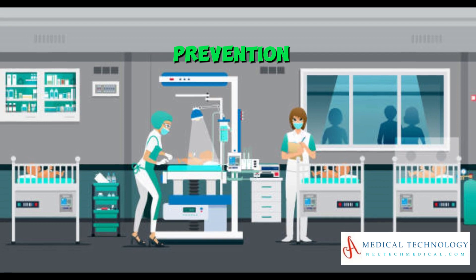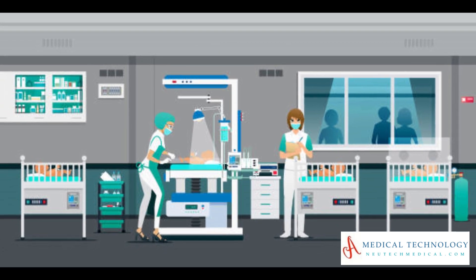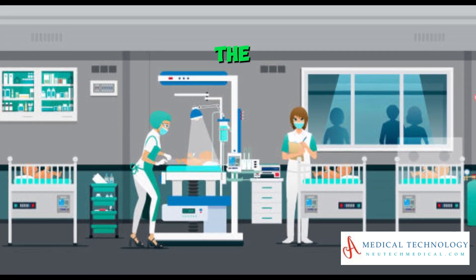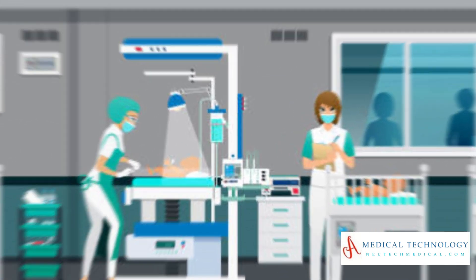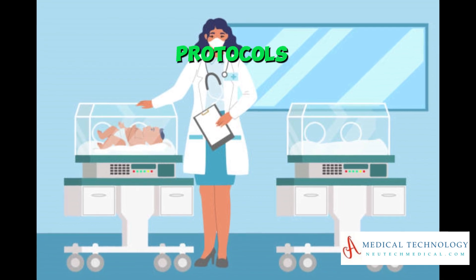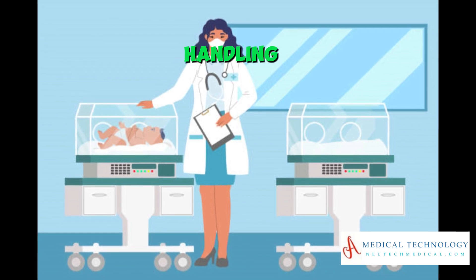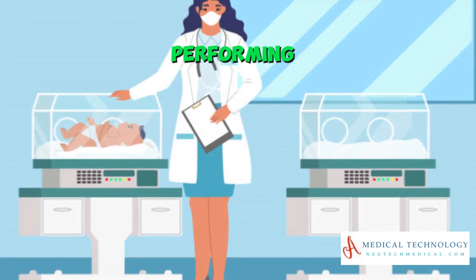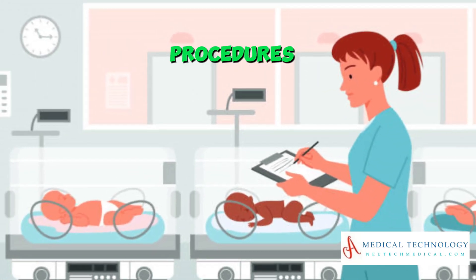Infection prevention: Maintain a sterile environment within the incubator. Adhere to strict hygiene protocols when handling the infant and performing medical procedures.